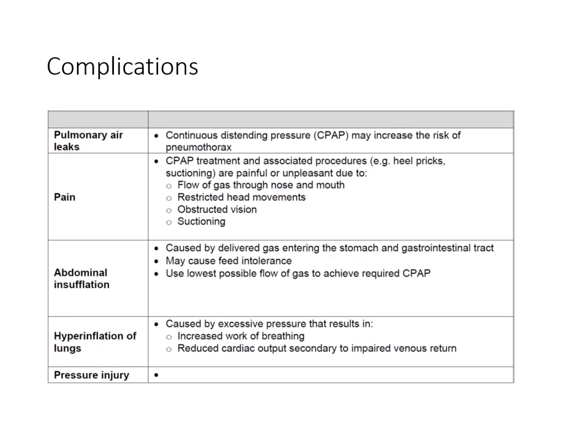Because there's a lot of flow that is going into the mouth, the abdomen also can get distended and that can cause feeding intolerance, which is called CPAP belly. So frequent aspiration of air is important. We can use slightly lower flows to decrease the abdominal distension with CPAP.